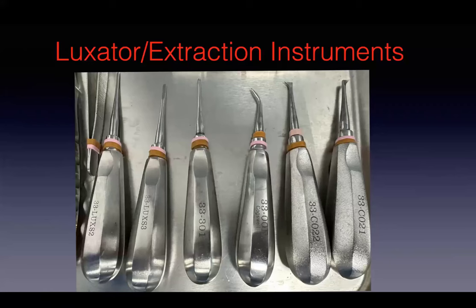So this is my instrument setup. I didn't include any forceps. You could just use your favorite forceps.